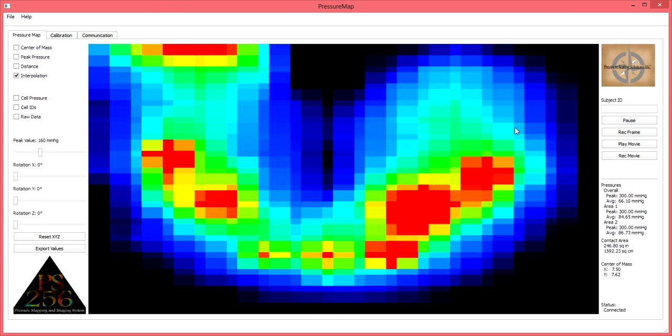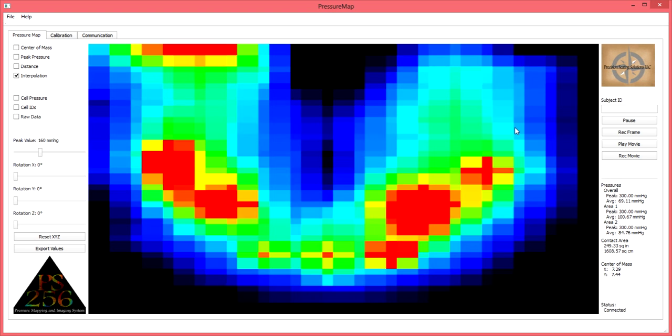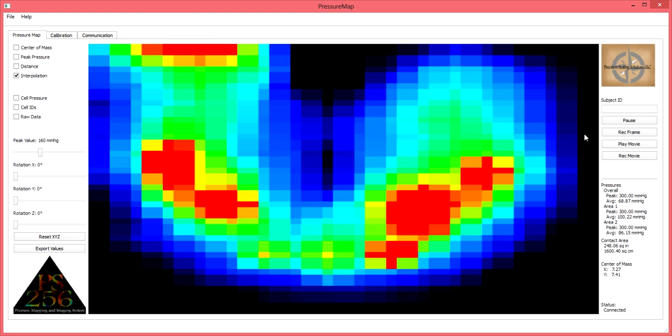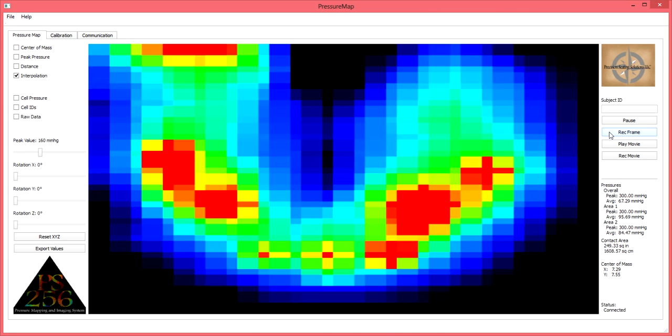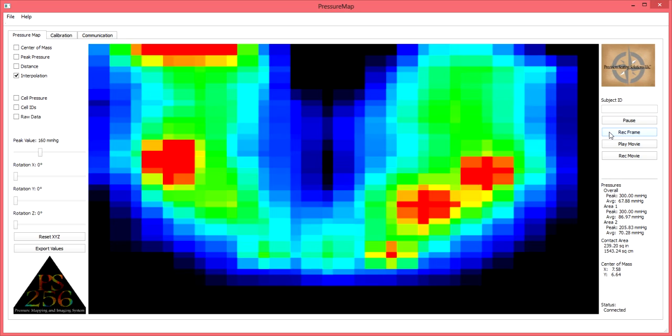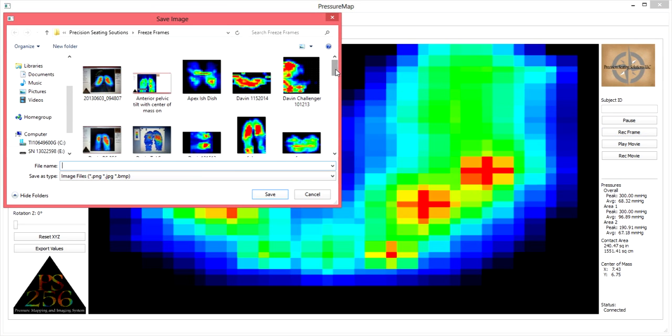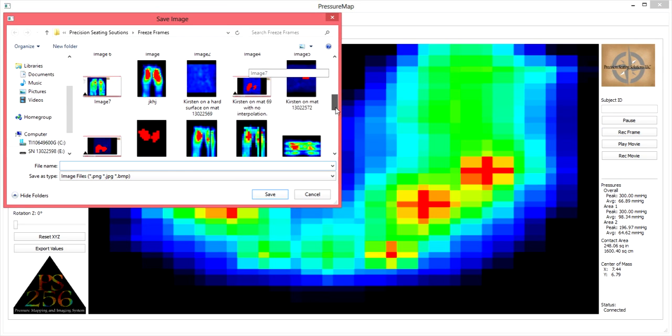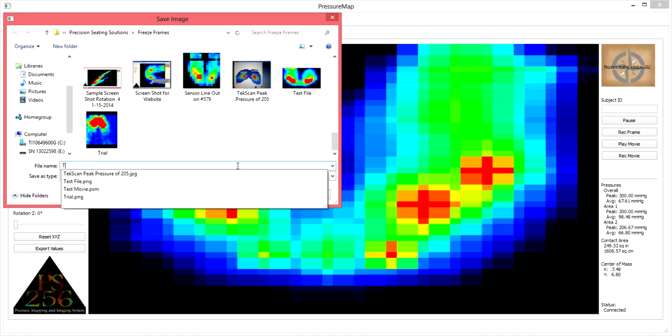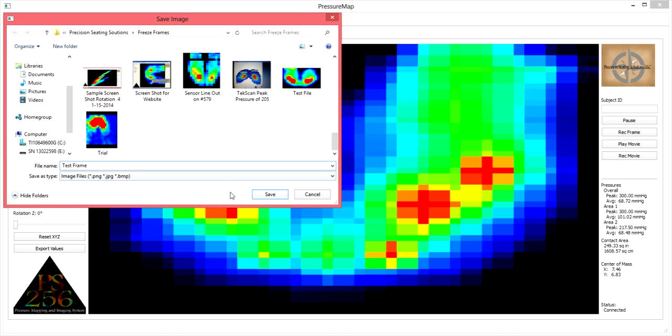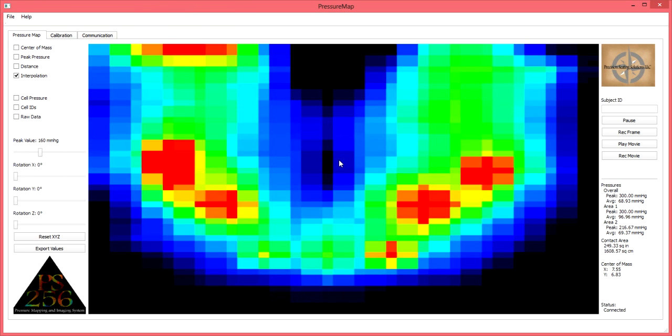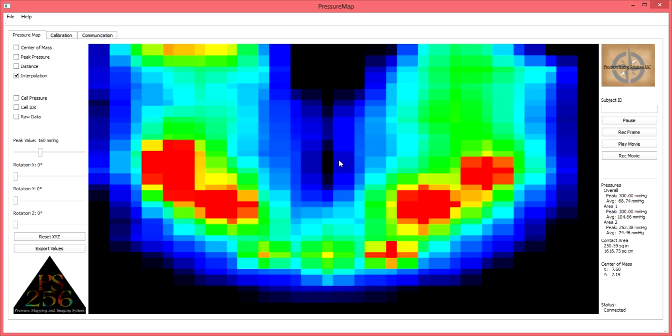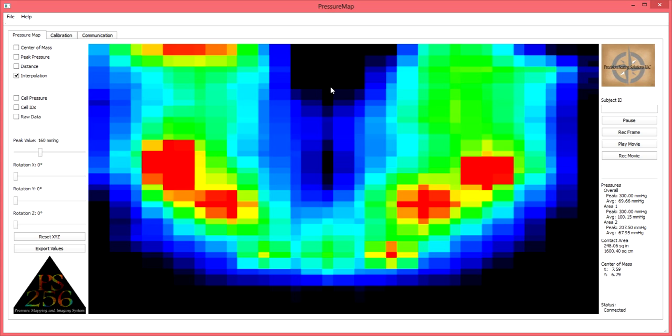In order to record a frame, simply click on the record frame option located on the right-hand side of your software screen. When you click on record frame, it will ask you, much like saving a Word document, where you would like to file this frame image and what you would like to name it. If we name this test frame and click on save, it will save that snapshot that we currently see as an image file for use with letters of medical necessity, for documentation, or for purposes at your discretion.